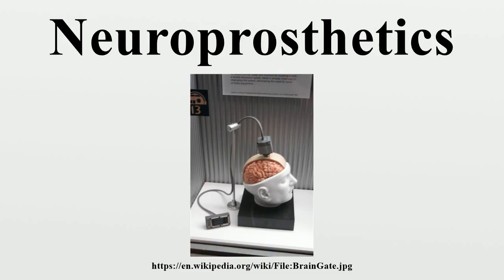For producing sound, see speech synthesis. Prosthetics for pain relief. The SCS device has two main components, an electrode and a generator. The technical goal of SCS for neuropathic pain is to mask the area of a patient's pain with a stimulation-induced tingling, known as paresthesia. Because this overlap is necessary to achieve pain relief, paresthesia coverage depends upon which afferent nerves are stimulated.